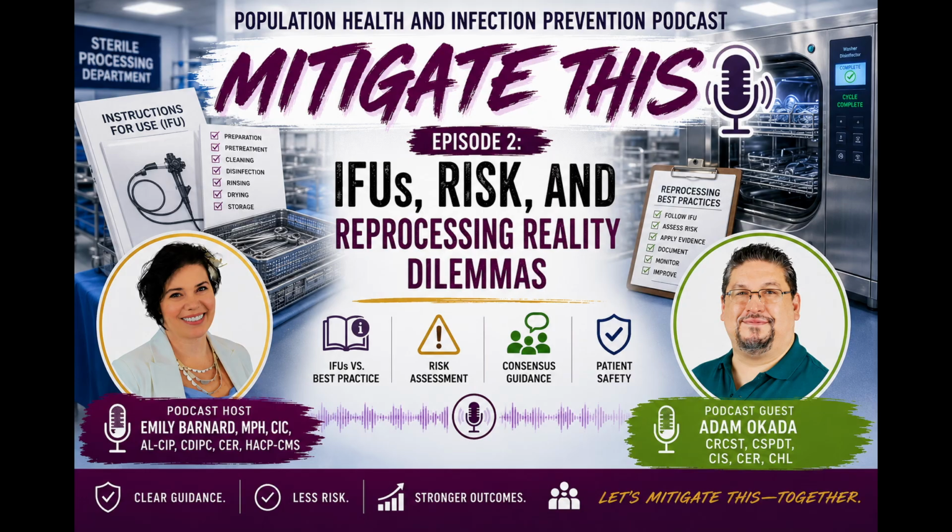They're not something that you're going to be surveyed to unless you're citing that or referencing it in a policy or procedure. And in that case, the surveyor will go back to that standard and see whether you are actually following it. So what I always tell people is, look, this is a best practice standard. It's going to raise the level of your practice. I think best practice standards are very important for us to be following, but for surveyors, they're not as important as following the IFU. So the IFU is paramount, along with your policies and procedures at the facility level. And again, best practice standards are essentially not followed unless they're cited in policy and procedure.